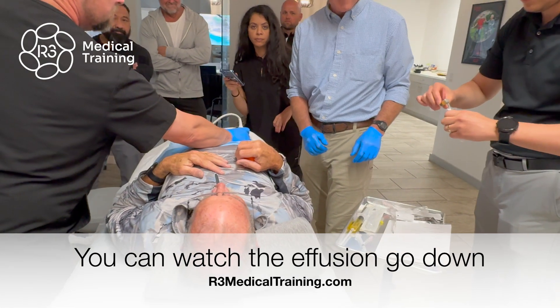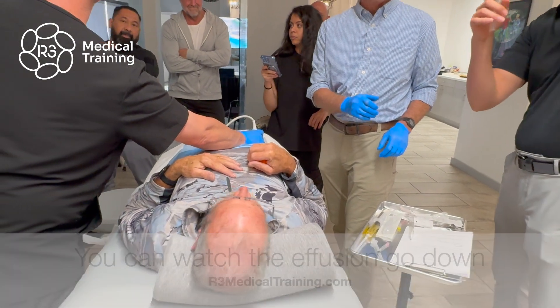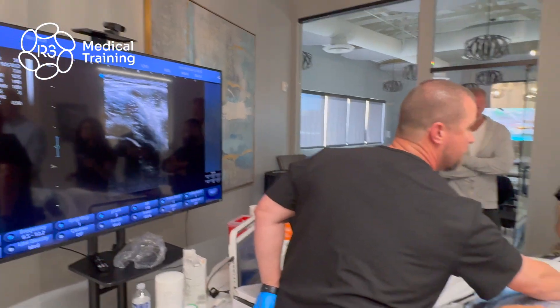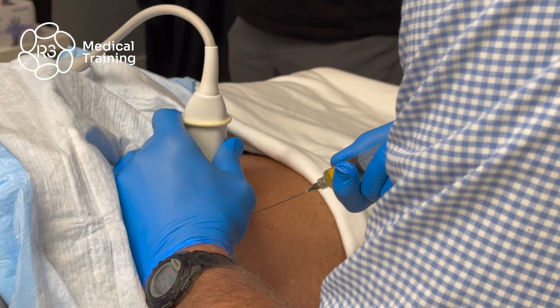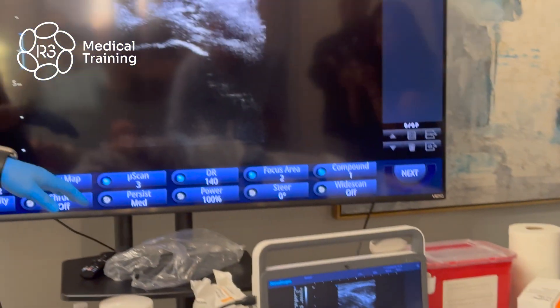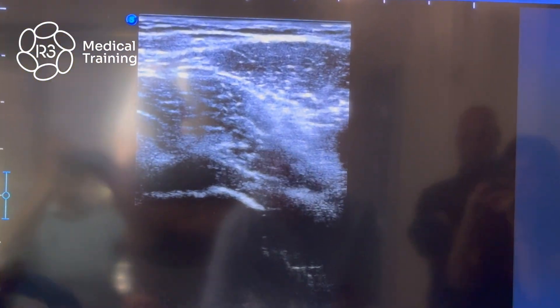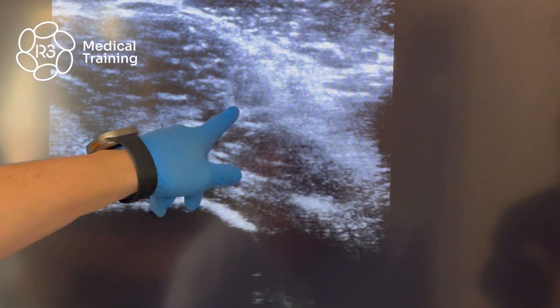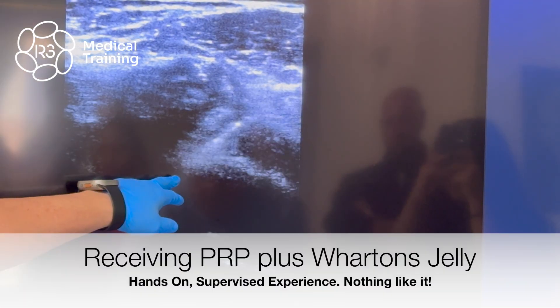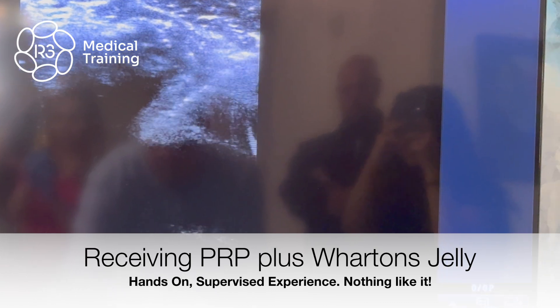The benefit of ultrasound is that without it you would not have seen or known that that fluid was there. The needle's coming in — stay still. There you go, go ahead. That's going to advance — keep advancing. I've got you, still right here, keep going.